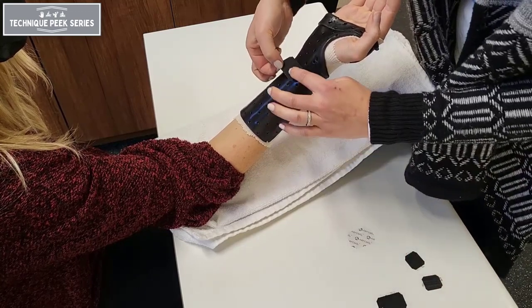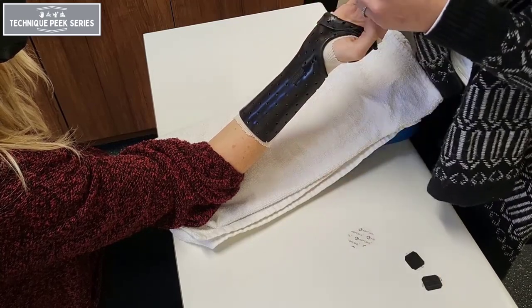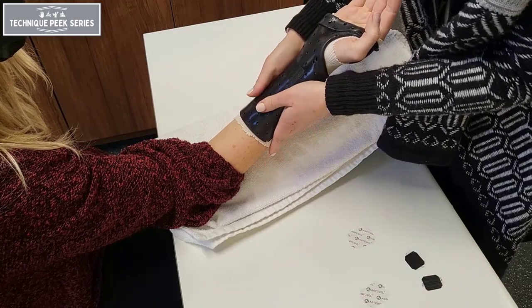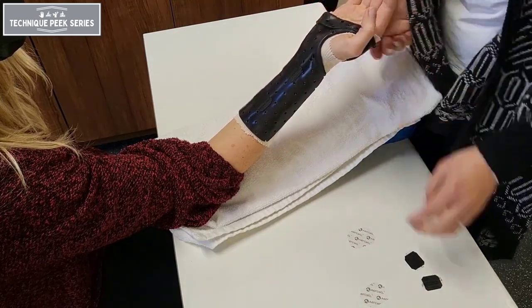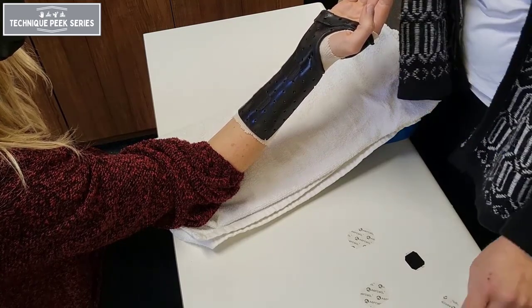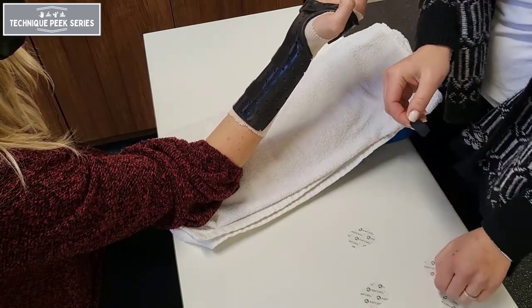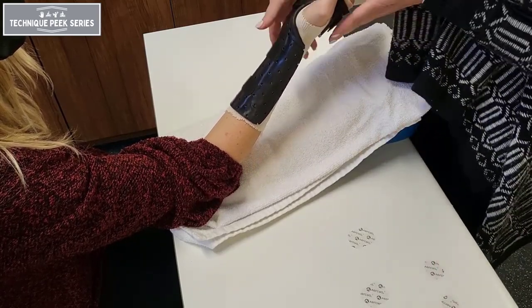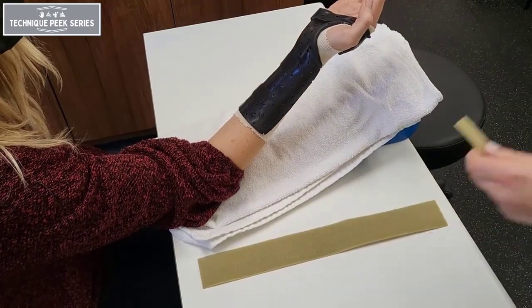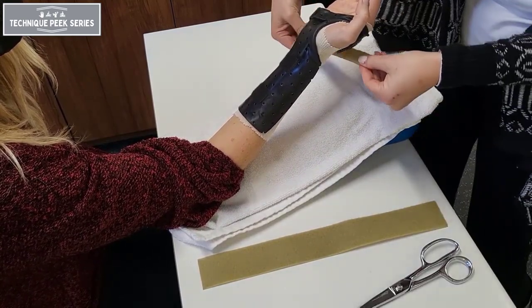Applying the velcro straps while the material is still slightly warm will help activate the adhesive. One strap is needed at the wrist crease, one proximal to the wrist crease, and the last at the hand on the dorsal aspect behind the distal palmar crease. Rounding the edges of your straps creates a nice aesthetic finish.